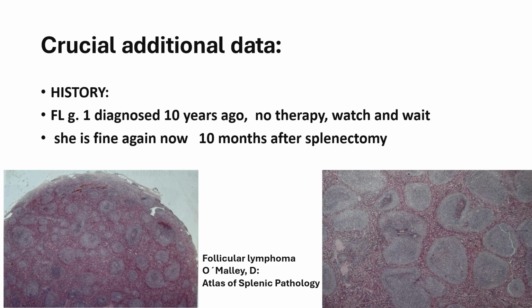So this is tricky because the spleen, which we have just seen, shows very subtle infiltration, and I think it would be very easy to diagnose it with traumatic spleen rupture. Next case. But you have just to be more careful.